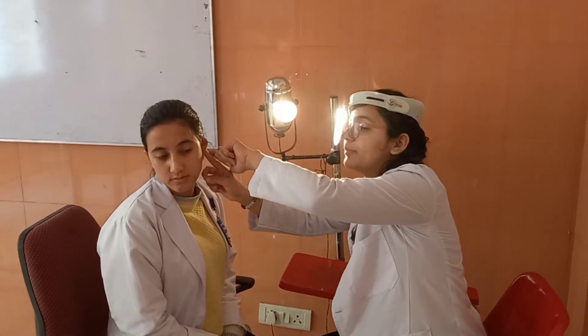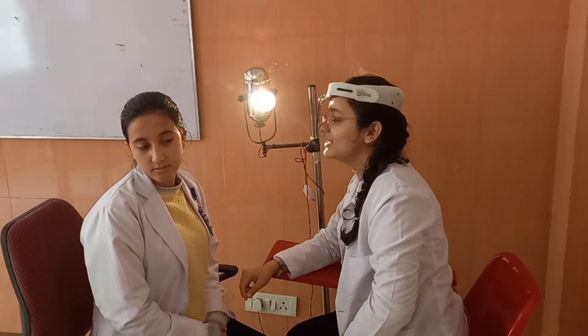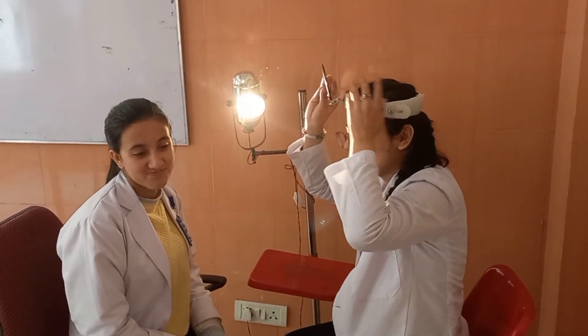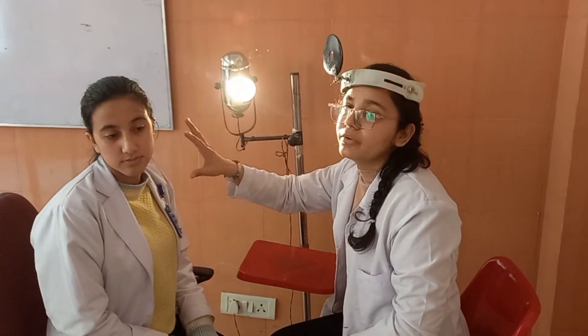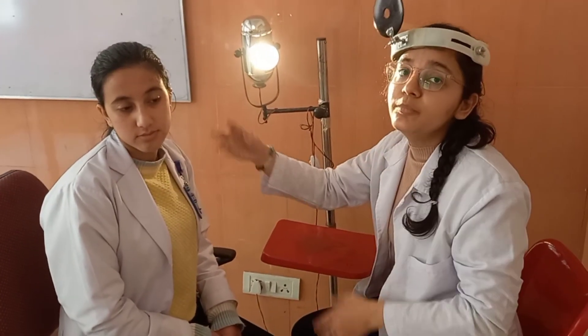During examination, you can talk about the external ear, middle ear, tympanic membrane, mastoid, and other parts. Please make sure you examine both ears — I've shown just one ear here, but you must examine both. Also, remember to keep your head mirror up — I forgot to do that. I'm being a little unfiltered because I'm also a student practicing for my examination, so you can learn from my mistakes too.